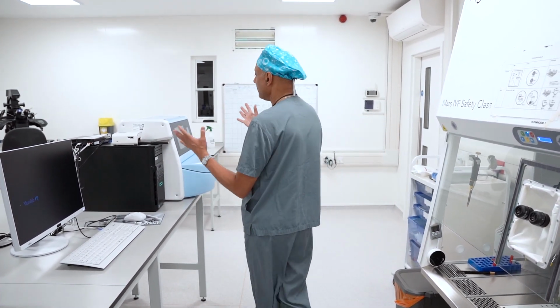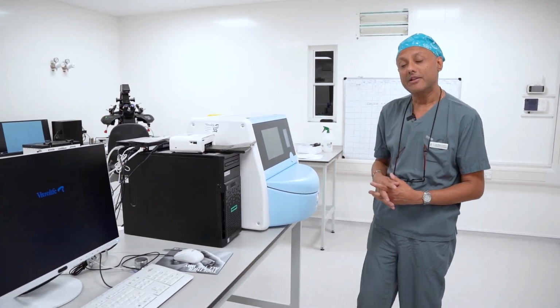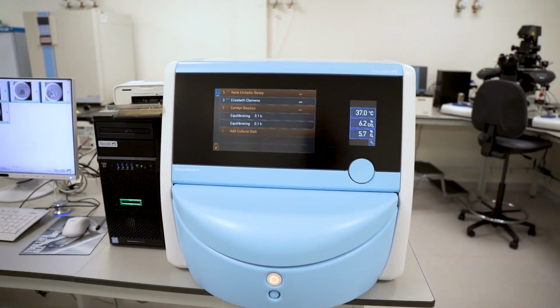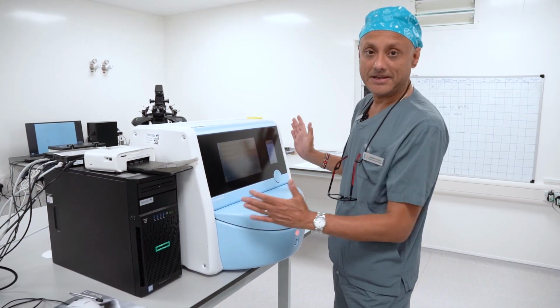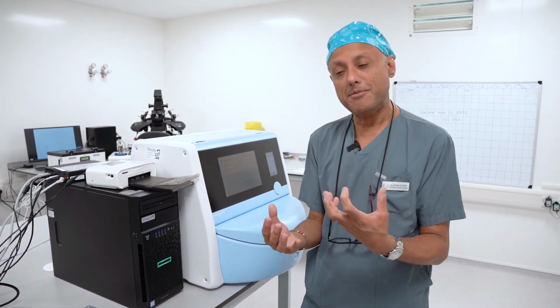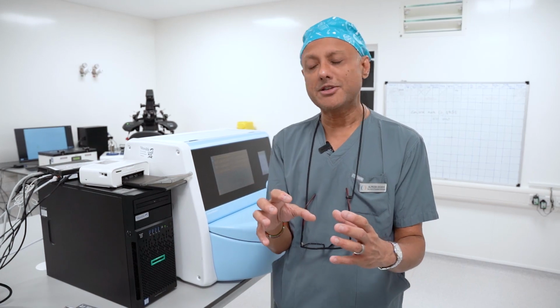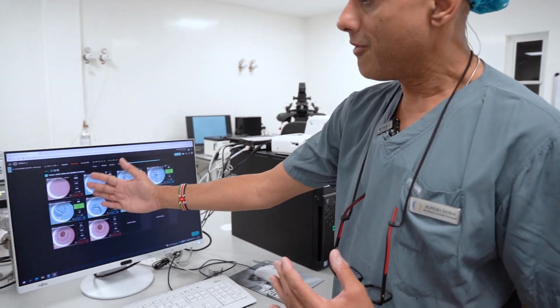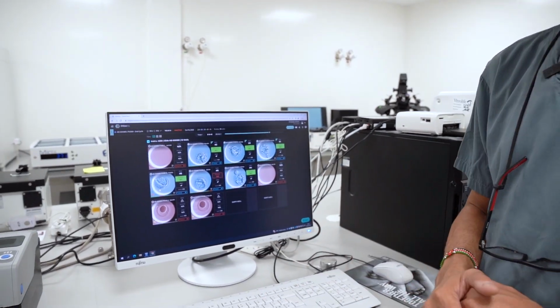We then move on to this piece of equipment here, which is called the embryoscope, and one of my colleagues may have already introduced this piece of equipment, but this is the incubator in which your eggs and embryos are being cultured. And whilst they're being cultured, we're continuously running AI on it so that images of your embryos are being captured as they develop. And whilst every 15 minutes of culture is capturing an image, there is a long video that we can run for patients whereby we can select the right embryos that are developing.